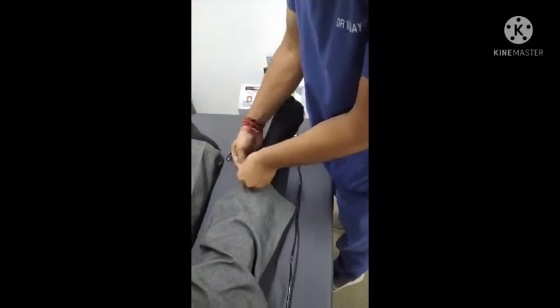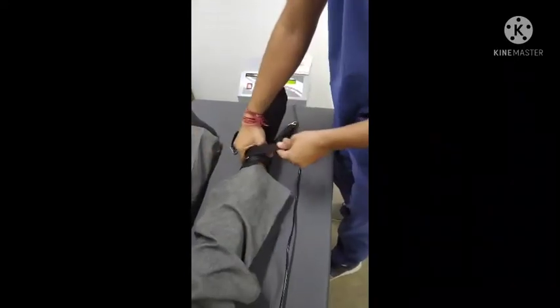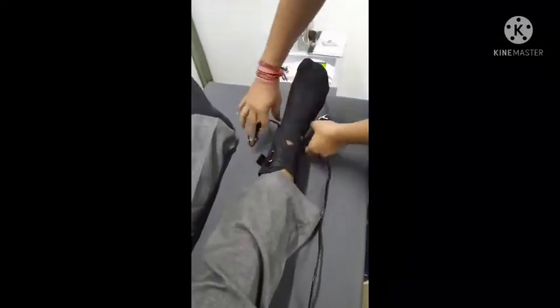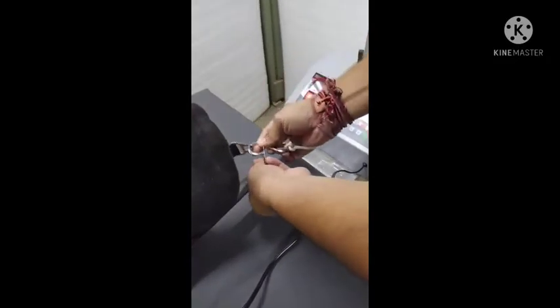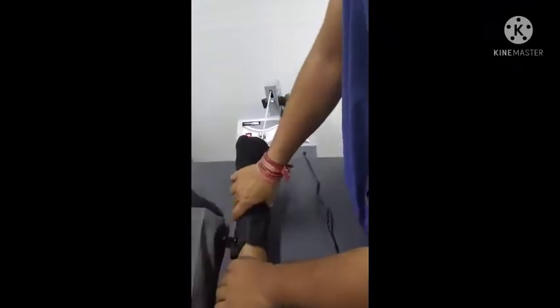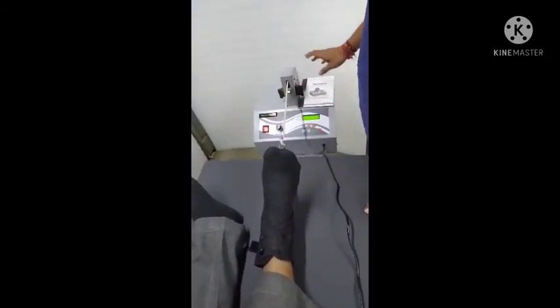These both are connected with the hook like this, and we have to place the patient's leg in front of the traction cord.